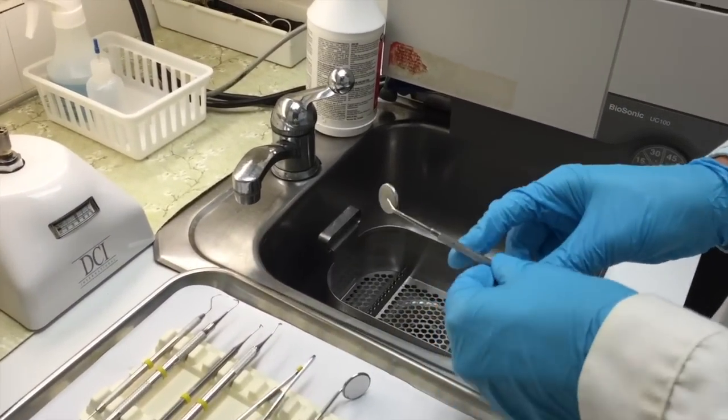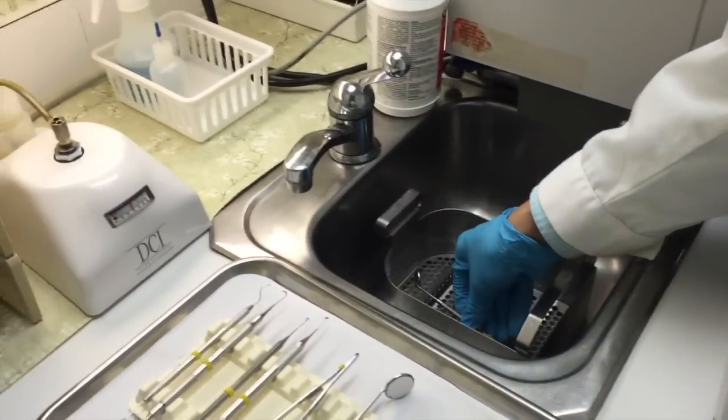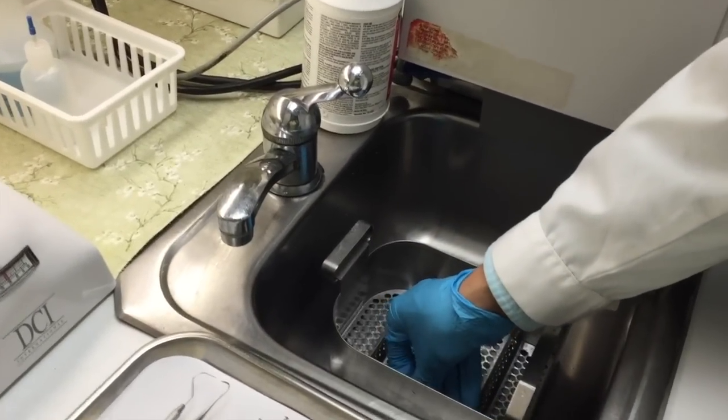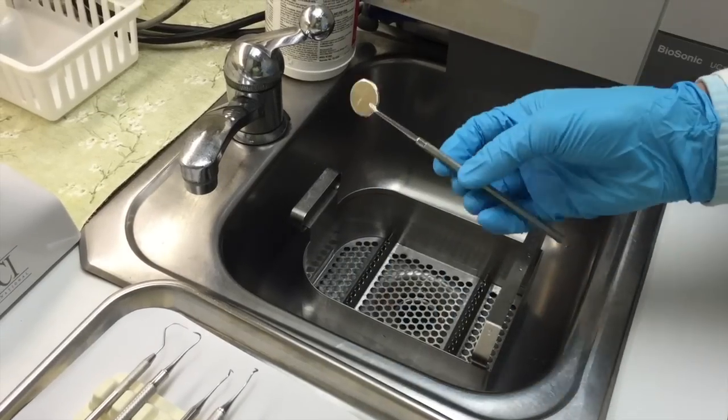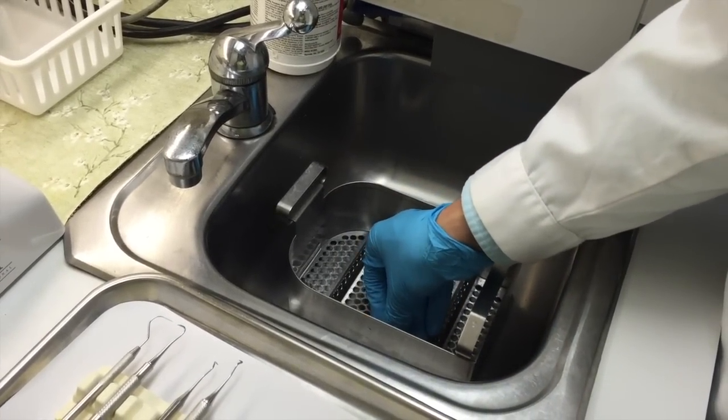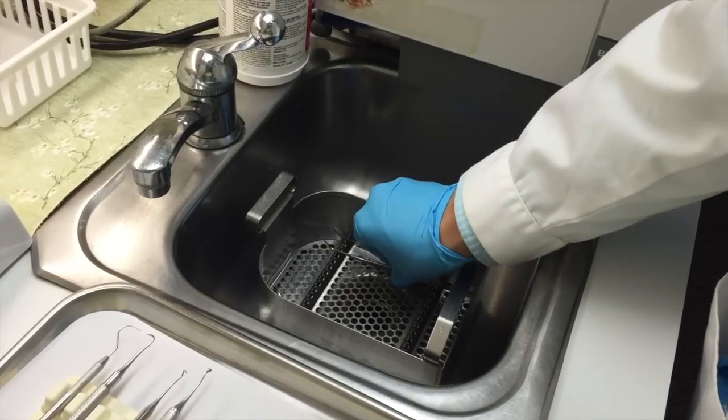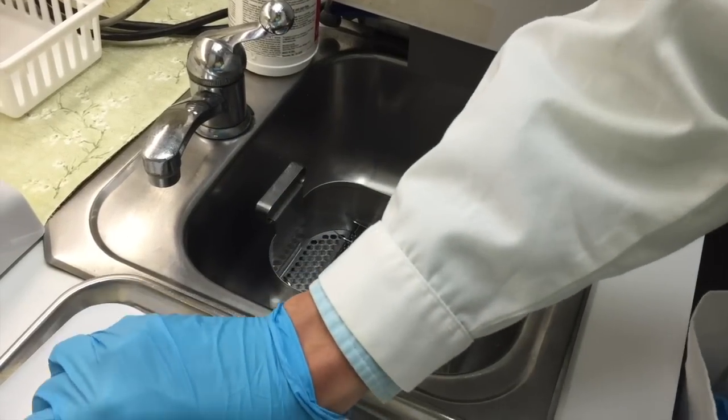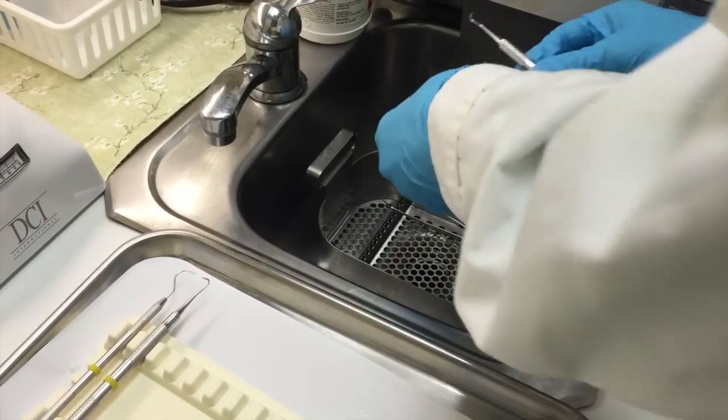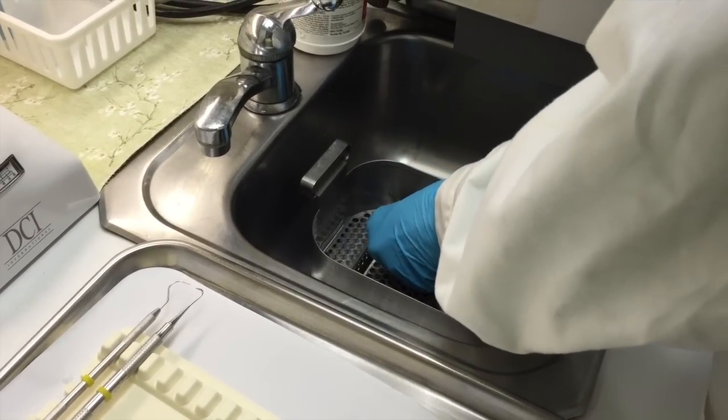The first thing we're going to do is put the mirrors in, because you have to be careful with these as to not scratch them. You're going to need to put them on one side of the basket facing the same direction so that when they're running through the ultrasonic cleaner, they don't scratch the surface of each other. Then you're going to put all of your other hand instruments on the other side of the basket, because these are sharp and could also scratch the mirrors.